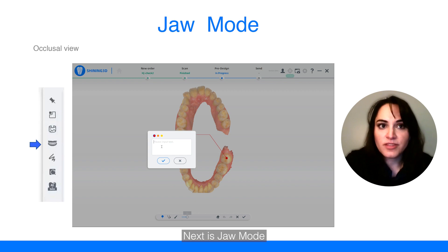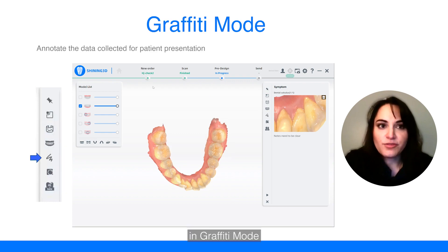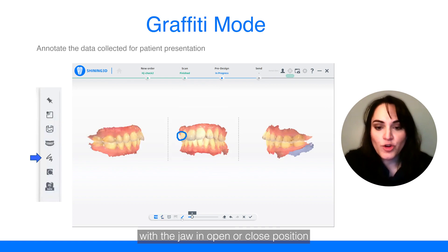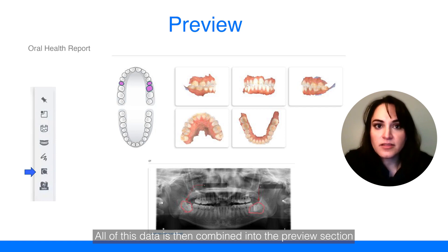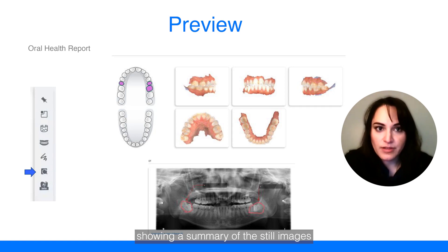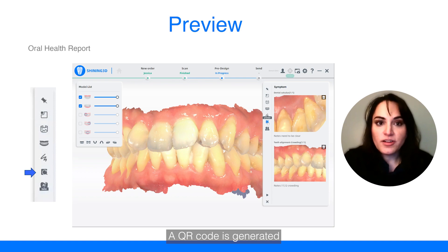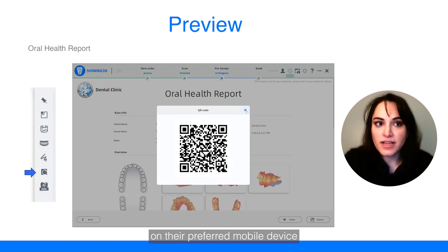Next is jaw mode. This provides an occlusal view and editing options mentioned previously. In graffiti mode, the clinician can mark the scan in freeze frame with the jaw in open or closed position. All of this data is then combined into the preview section. When selected, you can see the full report showing a summary of the still images taken and the notes made on every option reviewed. Go through this in detail with your patient as the clinical exam is performed. A QR code is generated, allowing the portability of the information provided to your patient on their preferred mobile device.